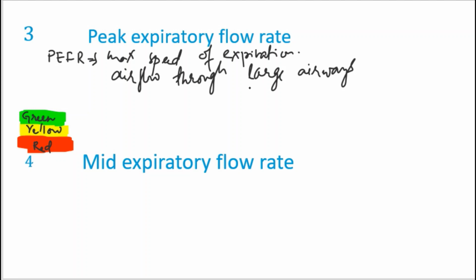You should remember that PEFR represents airflow through large airways, and this is classically reduced. PEFR is reduced during obstructive lung disorder.